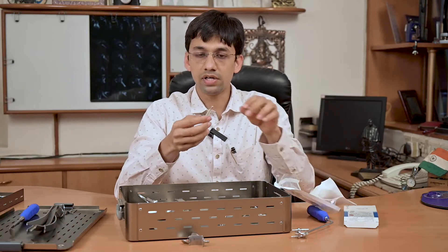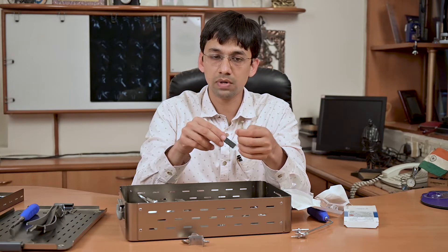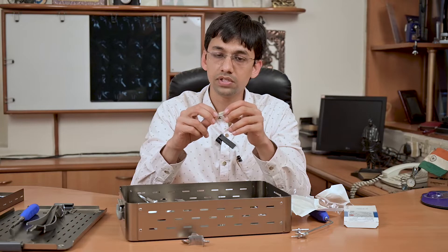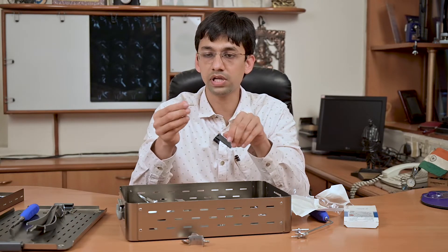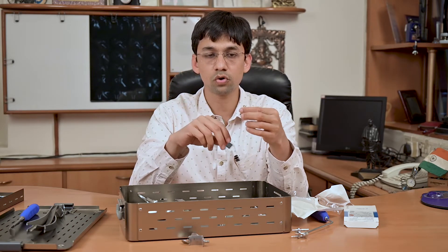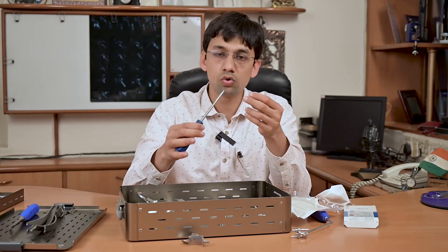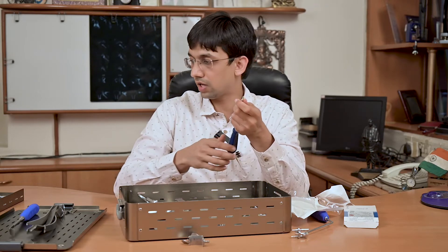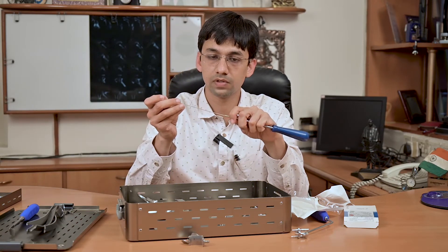The advantage of this screw compared to other cannulated screws available for trauma surgery is that it has a large head with a flat under-surface. This flat under-surface acts as a washer and helps in achieving compression of the coracoid process over the glenoid. The screwdriver is cannulated, the screw is cannulated, and both can be advanced over the guide wire.